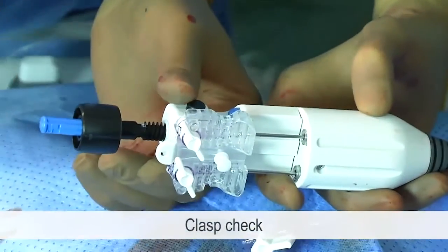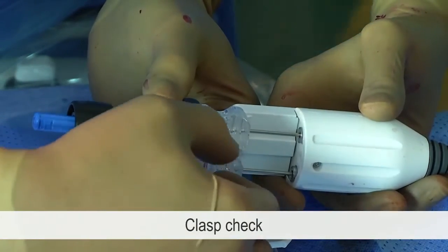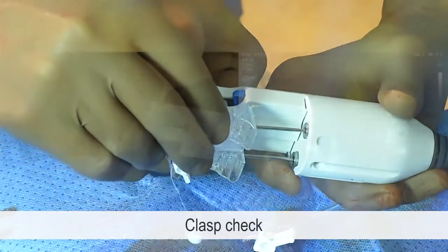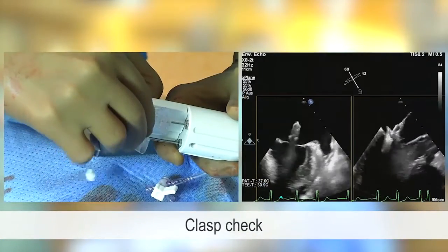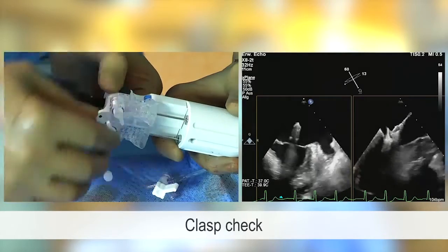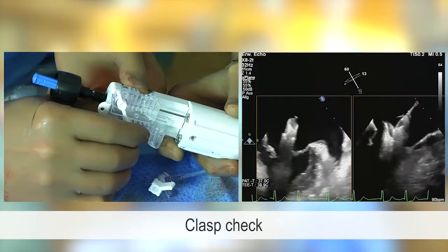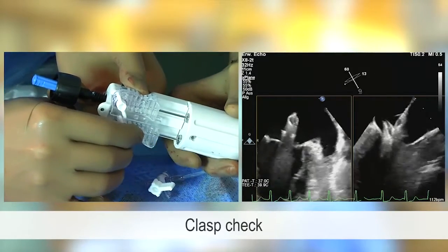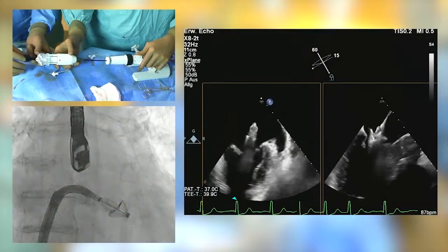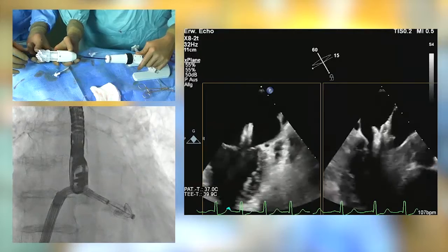My preferred mode of action with this device, if possible, is to do a simultaneous grasping, but obviously since we have the benefit of this specific feature to do staged grasping, we'd always like to have that ready, so we do a clasp checking to make sure what's the anterior and what's the posterior clasp. This is then the hardest part during the procedure, to remember which one was which, but therefore you have two operators.